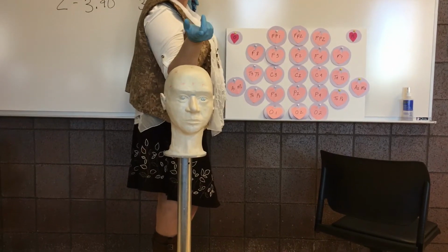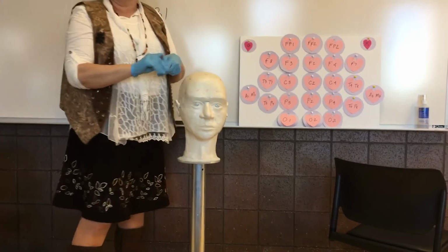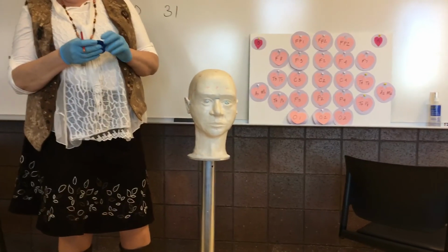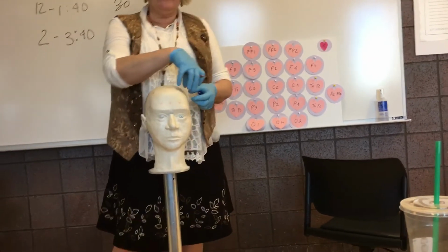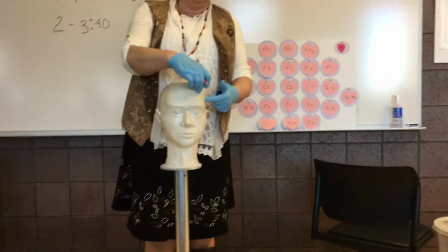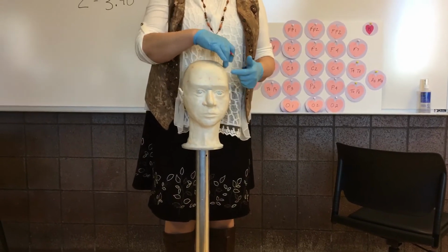I don't know. Aaron? Is there any case where you would deviate from symmetry? Or is symmetry sort of the golden rule? That's the golden rule. Okay. You might add an extra electrode. If someone has an abnormality that you're seeing, you might add an electrode in to map out that abnormality. So you might add electrodes.